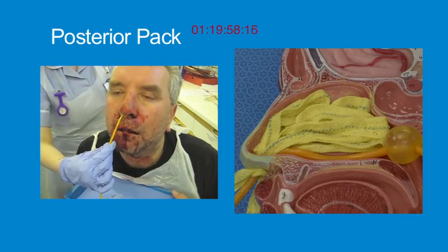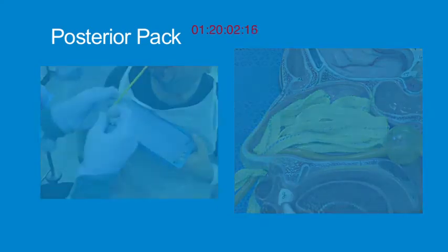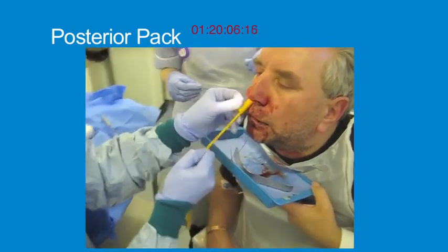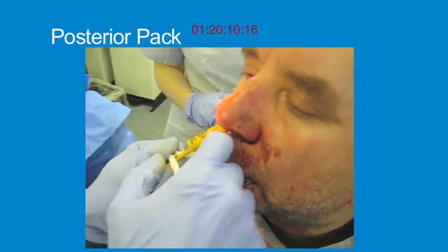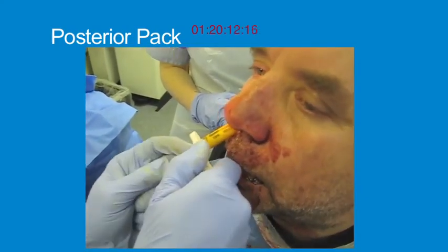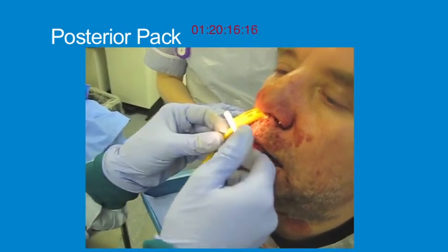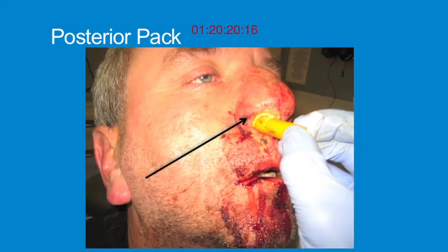As you will see, this is to avoid the catheter from touching the alar margin. Slide the catheter outflow port along the catheter to lie against the end of the BIPP dressing. Keeping the Foley catheter under tension, apply the umbilical clamp. This stops the catheter from moving and ensures that the posterior choana remains sealed. In this example, because I did not use quite enough BIPP packing, the catheter can be seen touching the alar margin. This risks alar necrosis.